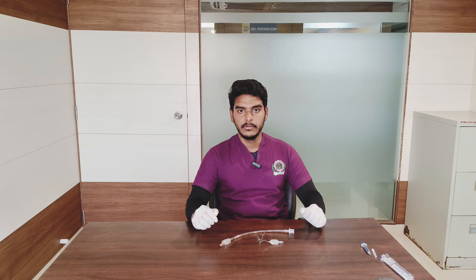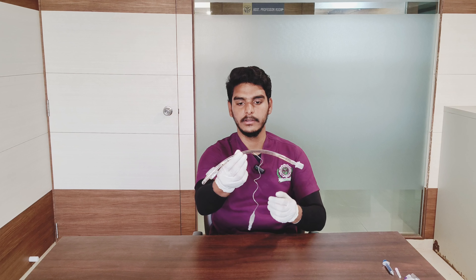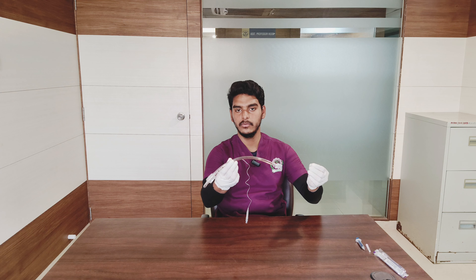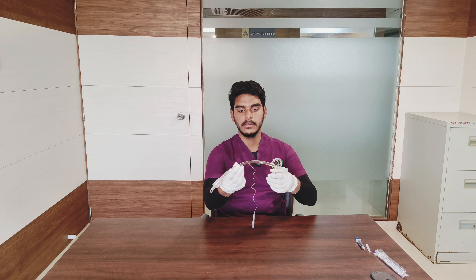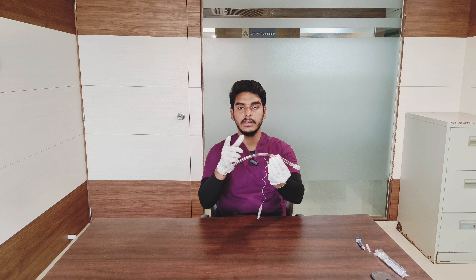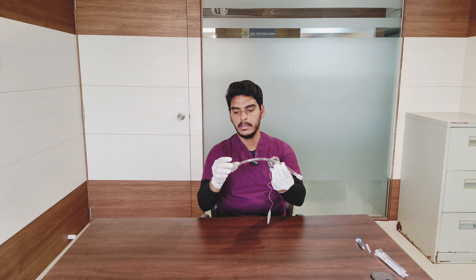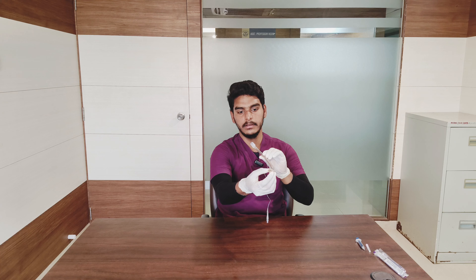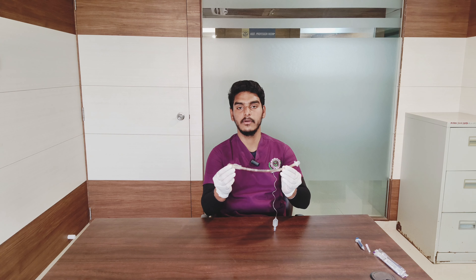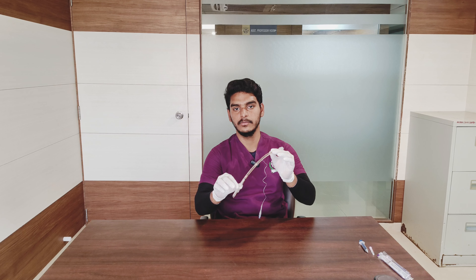Now I will discuss the endotracheal tube, which is the first type of airway. It is a curved tube with various parts. The adapter, also called the connector, is connected to an ambu bag or mechanical ventilator. The curved tube through which pressure ventilation is provided is the PVC tube, also called the polyvinyl chloride tube. The tip of the endotracheal tube is called the bevel, which is sometimes right-faced or left-faced.